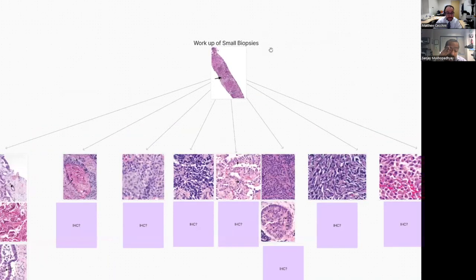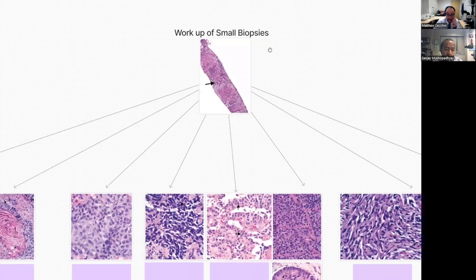Thank you for doing this, Matt. It's a great idea. The first issue with immunohistochemistry is cost and having the patient undergo unnecessary testing. The next issue is when you order a stain on a case where it's not really indicated, you then have to deal with the consequences if the stain doesn't do what you expect. So before you order the stain, think: what will I do if it's positive? What will I do if it's negative? And will it change what I'm already going to do without the stain? Those should be your questions to yourself.